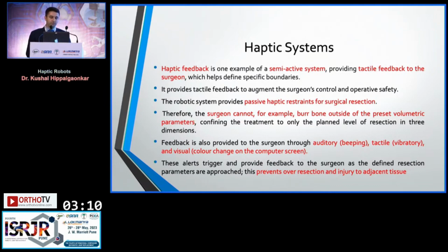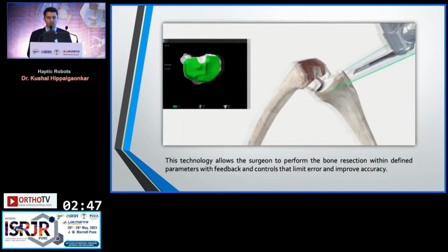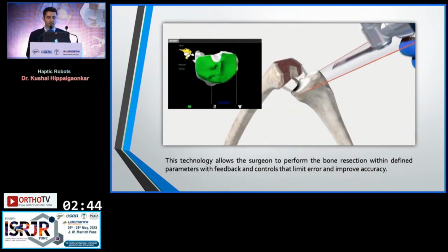So that's what we just discussed. Therefore, the surgeon cannot burr bone outside of preset volumetric parameters. Feedback is also provided to the surgeon through not just that force feedback, but also auditory, that could be a beeping, tactile, vibratory, and visual, the color change on the computer screen. These alerts trigger and provide feedback to the surgeon, and therefore it prevents over-resection and injury to adjacent tissues. So this is what the concept of haptics is in the Mako.